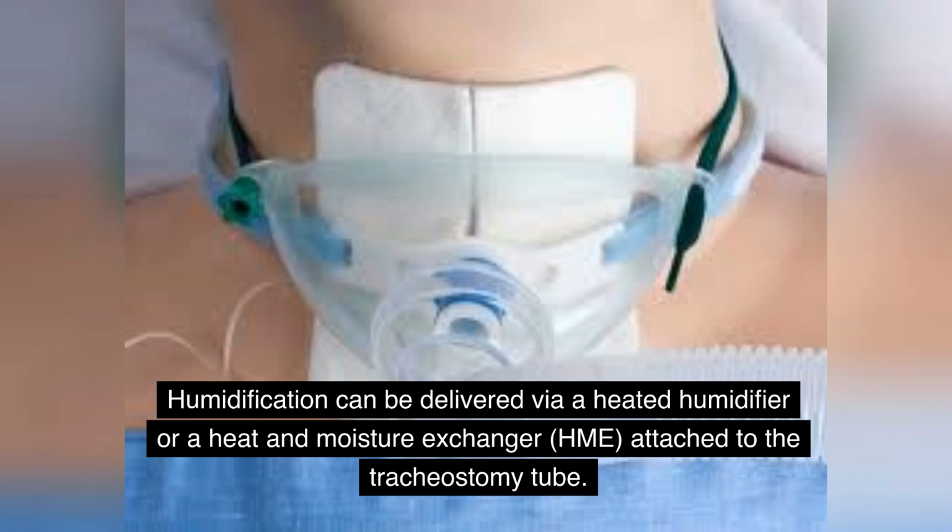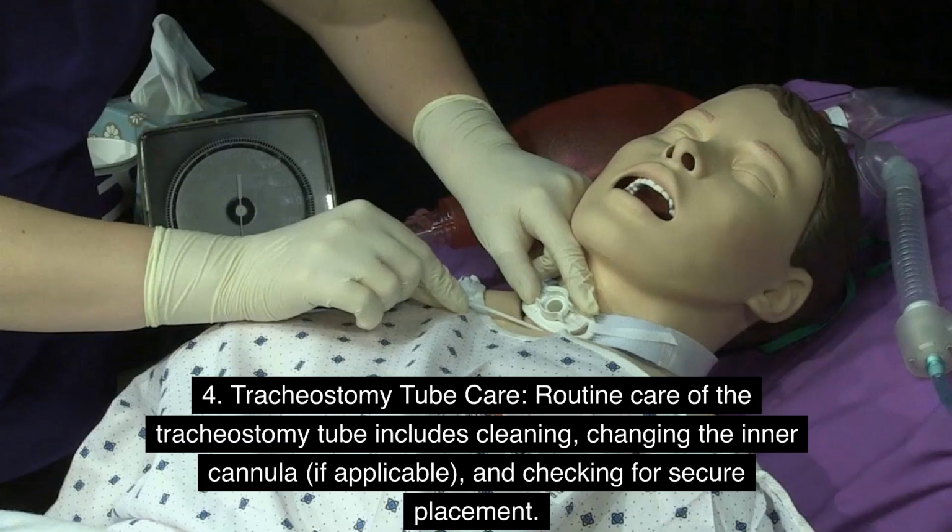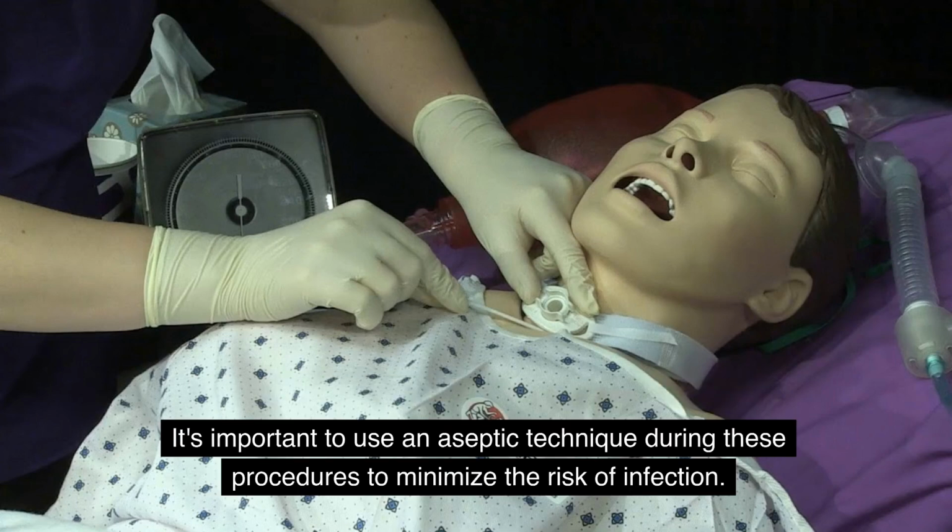Humidification can be delivered via a heated humidifier or a heat and moisture exchanger, HME, attached to the tracheostomy tube. 4. Tracheostomy tube care. Routine care of the tracheostomy tube includes cleaning, changing the inner cannula, if applicable, and checking for secure placement. It's important to use an aseptic technique during these procedures to minimize the risk of infection.